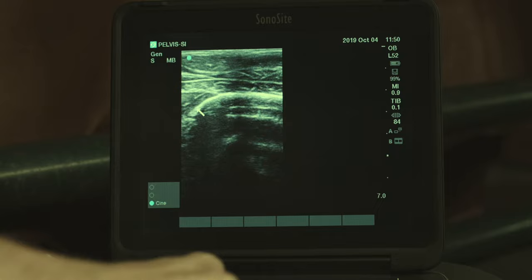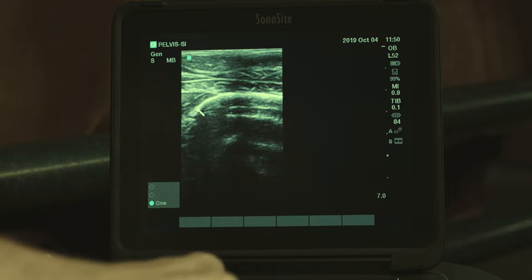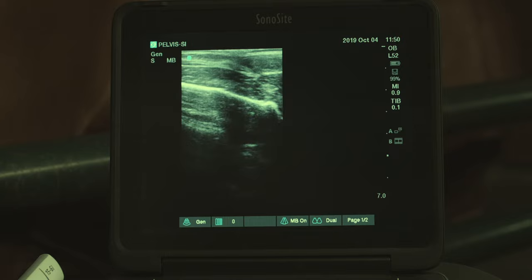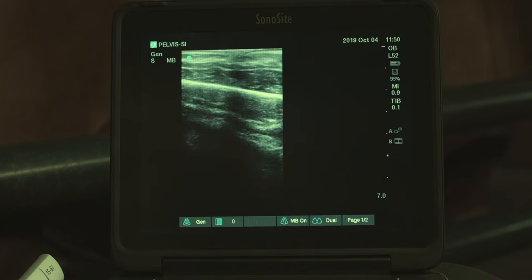I'm going to continue on the ischium table to the caudal aspect — on the pelvic specimen that will be simply sliding from the cranial edge back to the caudal edge. You can see as I move back from the cranial edge, I just look for this nice white contiguous portion of bone. If you have a fracture, it's either going to be contiguous or it's not. There's no secret to it. You can see as it dives off the caudal edge.